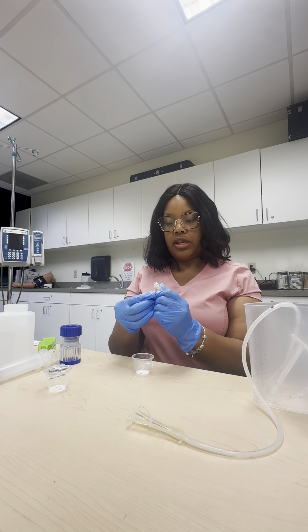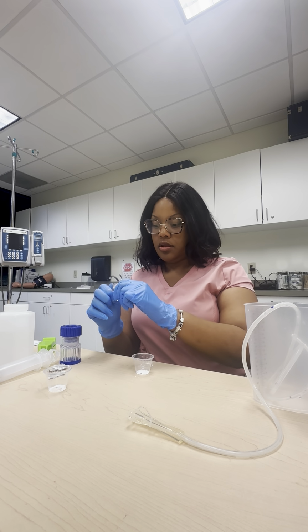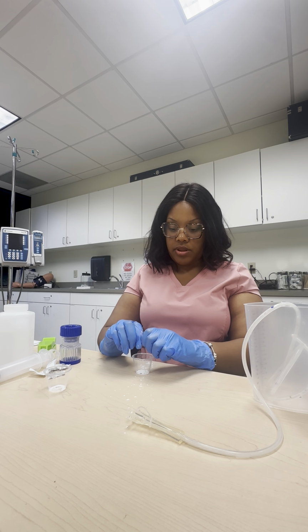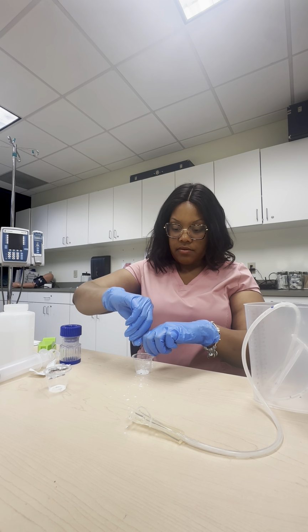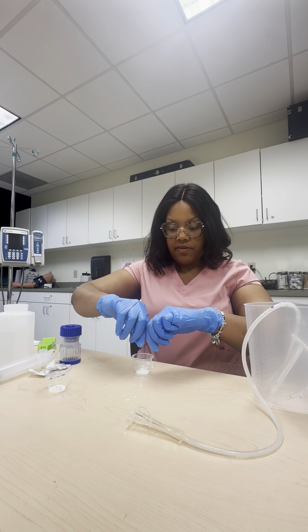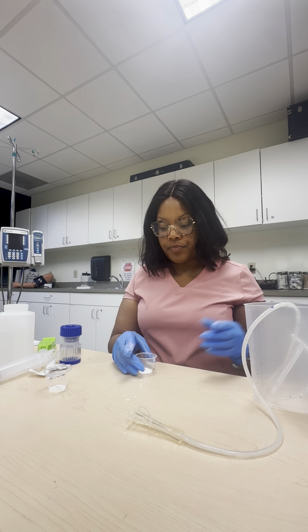And then we'll do the next one. All right, we will open that one. It's so messy opening capsules and stuff. All right, we empty that side out. All right, so now we've got them both empty. All right, so now we're ready.